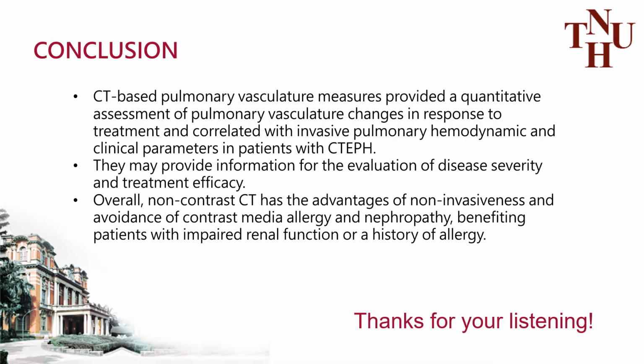Conclusion: CT-based pulmonary vasculature measures provide a quantitative assessment of pulmonary vasculature changes in response to medical treatment and correlate with invasive pulmonary hemodynamic and clinical parameters in patients with CTEPH. They may provide information for the evaluation of disease severity and treatment efficacy.